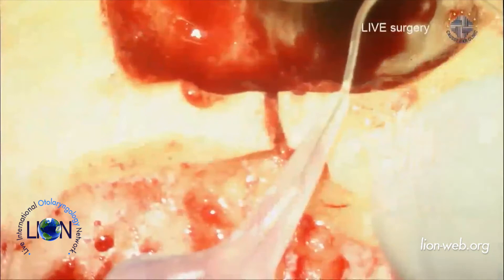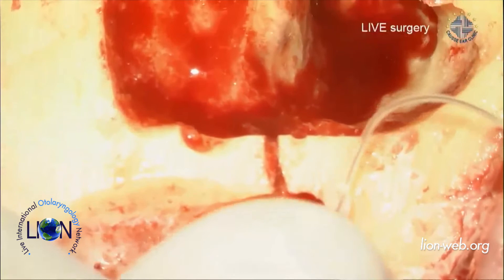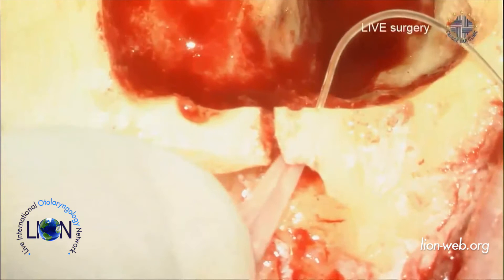I will now put the implant into the subperiosteal pocket. Just in case you haven't noticed, the audiogram in the booklet is not the right one — the audiogram shown on screen is the correct one. Now I put the implant — I have to attach the coupler first before proceeding.